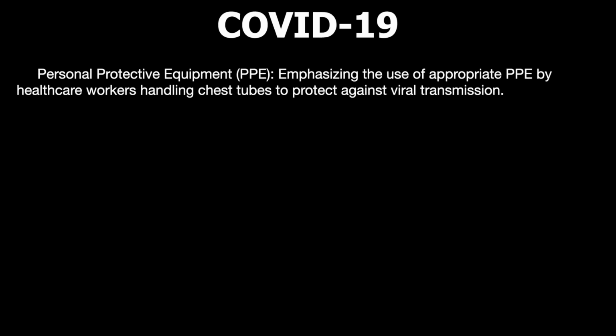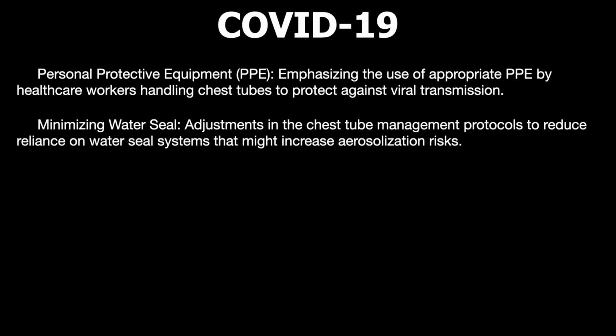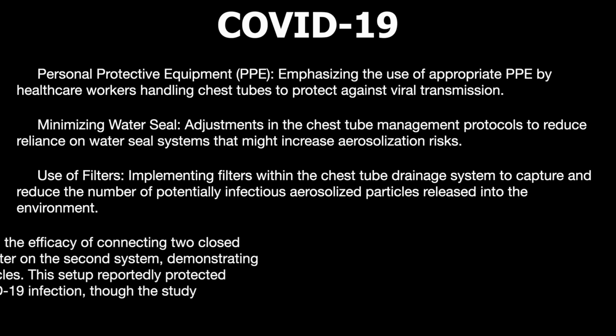Regarding COVID-19 and the use of ICDs, the use of PPE, emphasizing the use of appropriate PPE by healthcare workers handling chest tubes to protect against virus transmission. Now, adjust the chest tube management protocol to reduce reliance on water seals that might increase aerosolization risk, and implement filters within the chest tube drainage to capture and reduce the amount of potential infectious aerosol released into the environment.